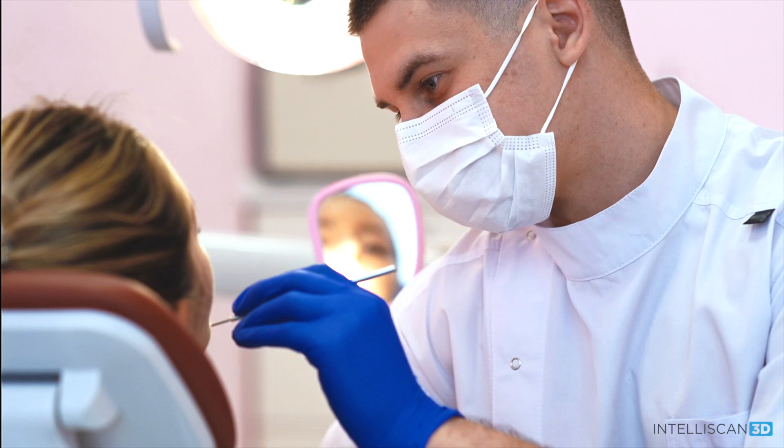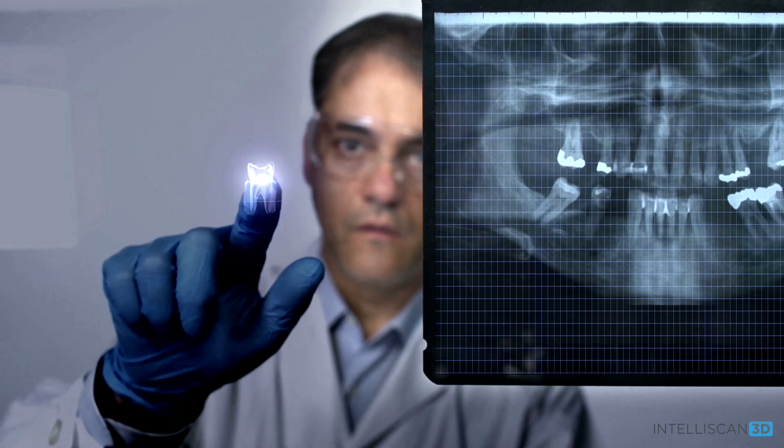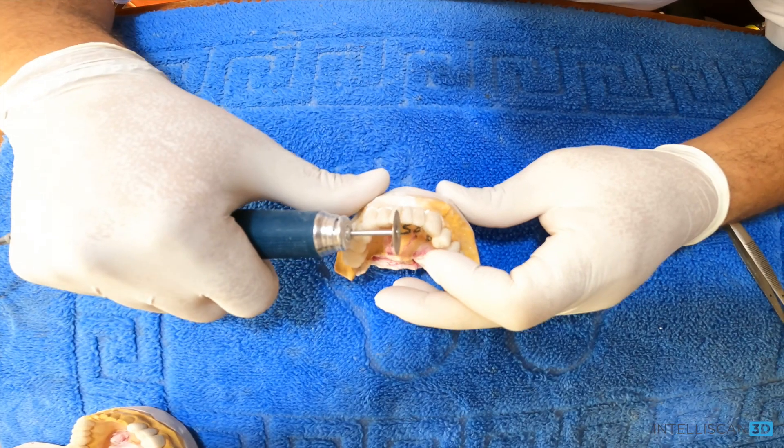I love dentistry, and we are lucky to be practicing dentistry in a time of incredible evolution, both in materials and technology. And that's why today I'm so excited to talk to you about the evolution of intraoral scanners and share with you my journey so far through the intraoral scanning world that is changing the face of dentistry.